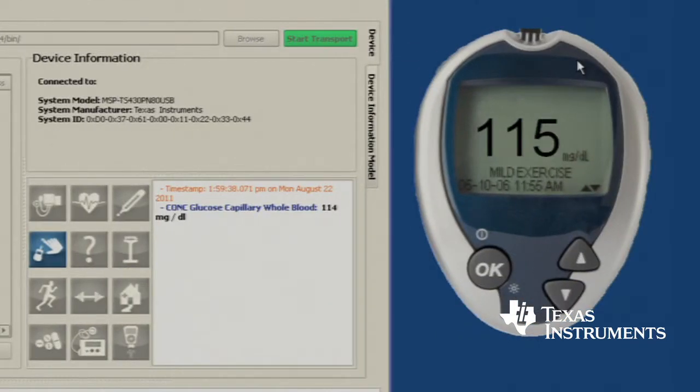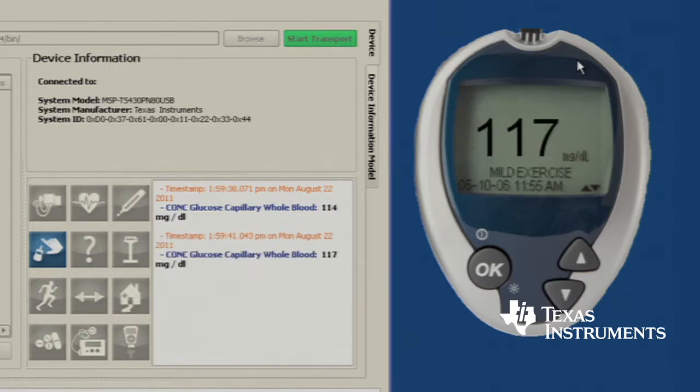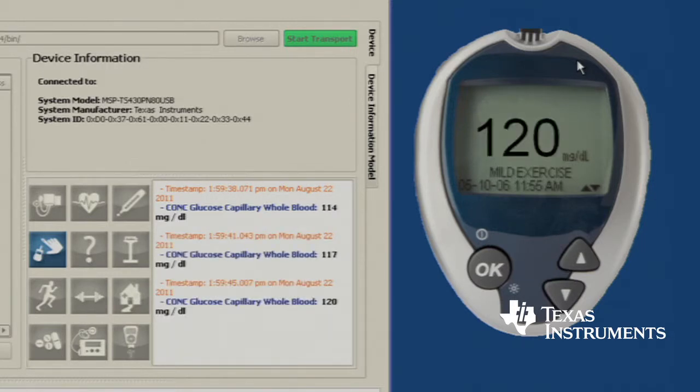We can see here on the Continua Manager GUI that it has recognized our board as a blood glucose meter, and it received the reading.